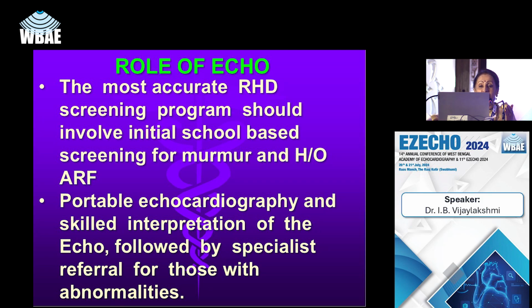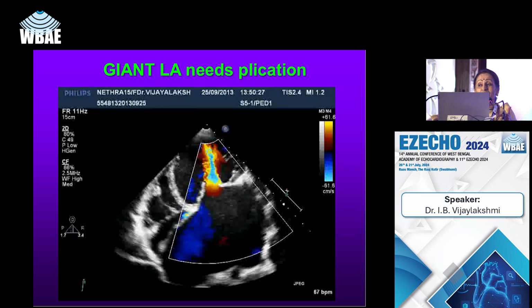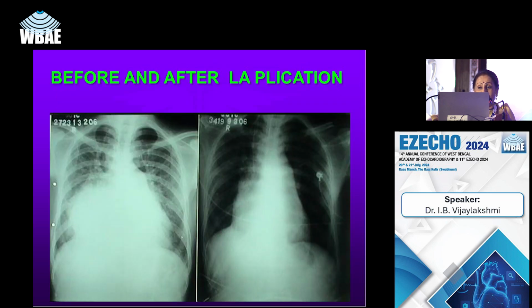So here, outcomes in our own hospital: we have 1686 repairs done in 18 years, and 5 replacements were done later on for endocarditis. Most of them did very well, and this is published in the book. So friends, echo plays a major role in prevention, treatment as well as prevention of the complications. So to conquer the rheumatic heart disease, we have to use the echo criteria and be specific about what we do. Echocardiography is the key technique used to confirm the diagnosis of the valve lesion.